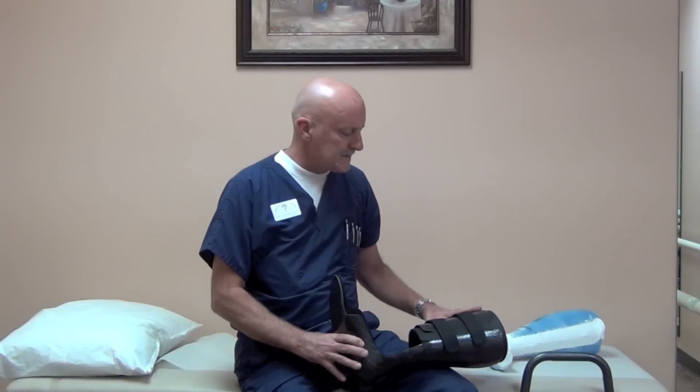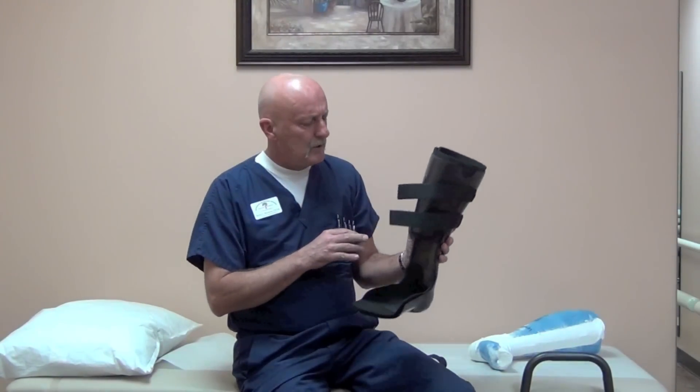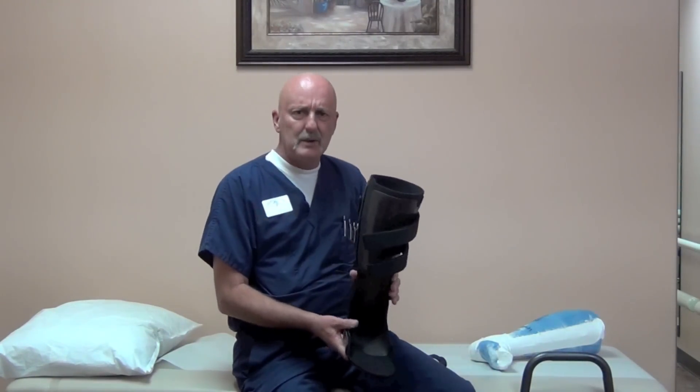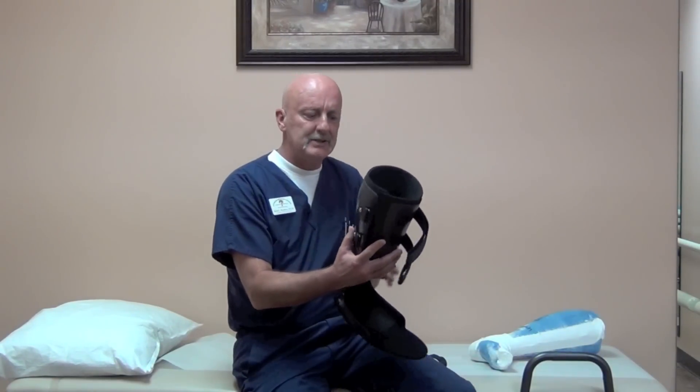Hi, my name is Kevin Matthews and I'd like to introduce you to a new AFO design we're offering in my practice. What we call it is the load shifter AFO, and what it's designed to do is to carry weight that would normally be borne through the distal tibia, talus, and heel to be carried in the calf area of the patient.